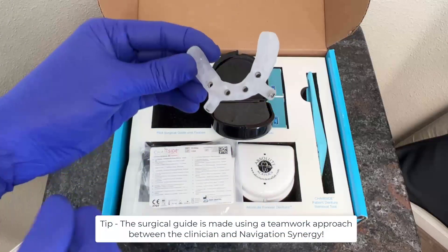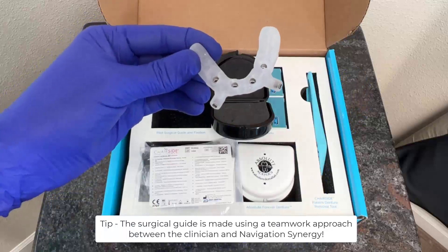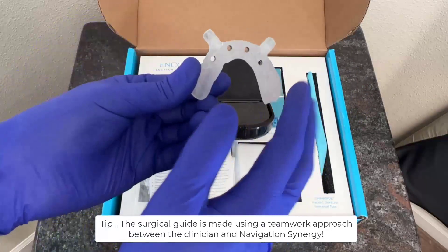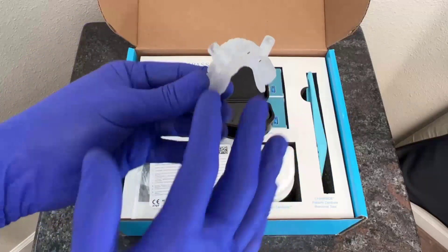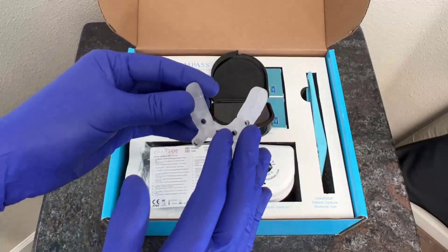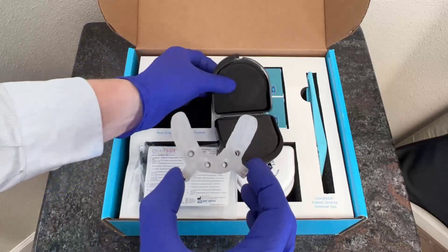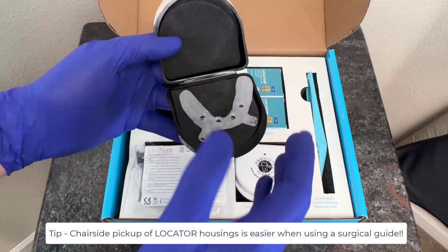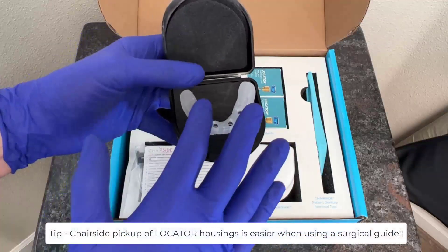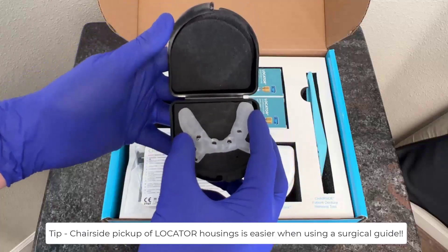In addition, we have two anchor pin holes, so that way we can go ahead and drill and place anchor pins to help stabilize the surgical guide. The surgical guide is based upon the scan of the patient's denture and the merging together of that scan and information in our 3D treatment planning with the Navigation Synergy team. The surgical guide is going to provide an effortless and streamlined approach to get our implants in the desired positions as according to the prescribed surgical plan.